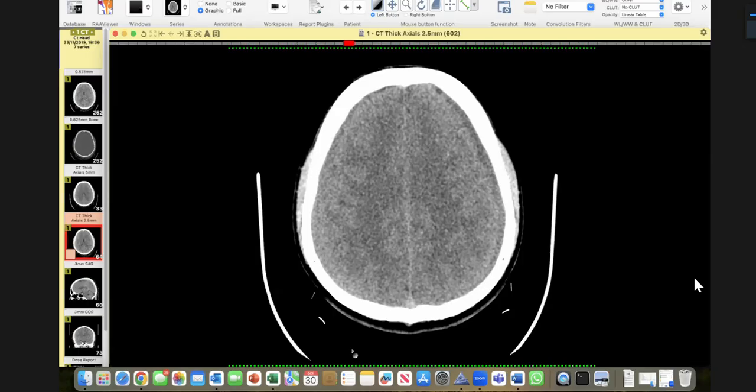And when you do MR highly T2-weighted sequences, you might see a pool of CSF, which tells you that there is a tear. But there are other types in which there are CSF venous fistulas, etc. It's too complex for the 2B world, so don't worry about it.